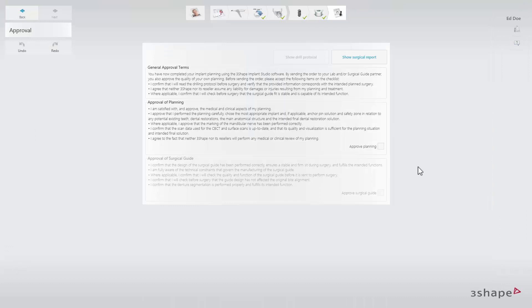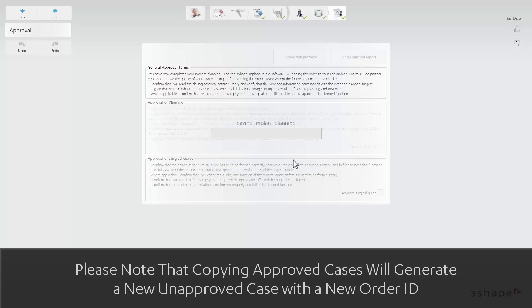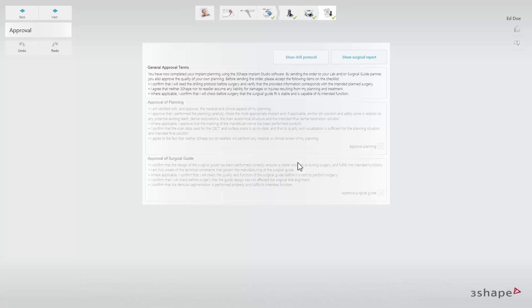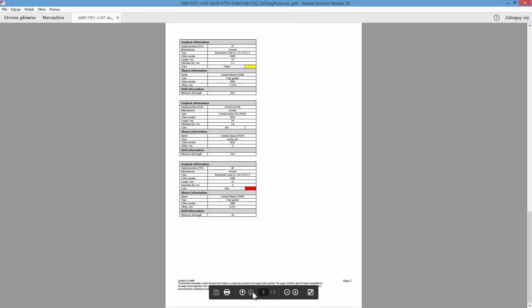You can approve the implant planning and surgical guide individually. Click the corresponding checkboxes for approval. A warning message will appear informing you that after the approval, you will not be able to edit the implant planning or the surgical guide. Click Yes if you agree and wish to proceed. A drill protocol will be generated after you approve the case, which you can view by clicking Show Drill Protocol in the Approval window. The order will be saved and the output will be generated.